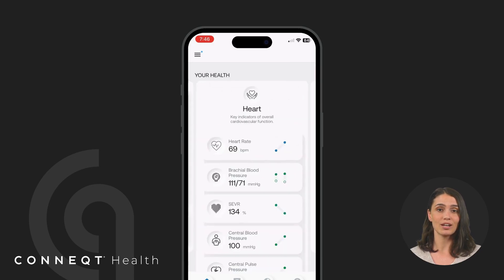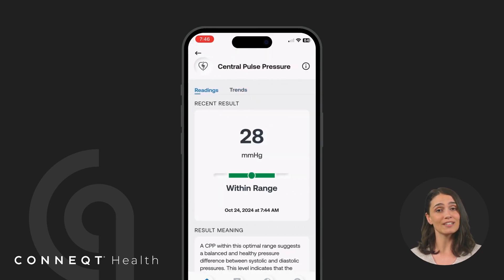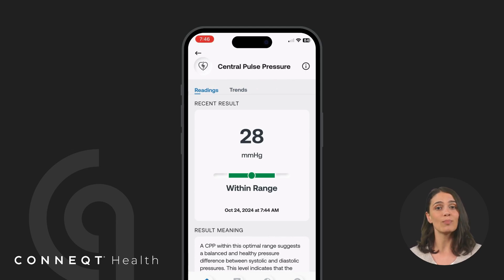Central pulse pressure, CPP, reflects the pressure experienced by major organs like the heart, brain, and kidneys, helping signal the risk of end-organ damage.